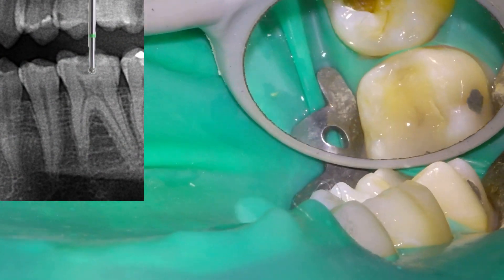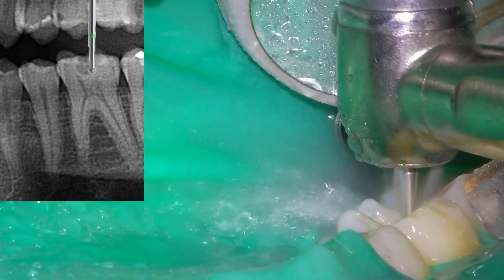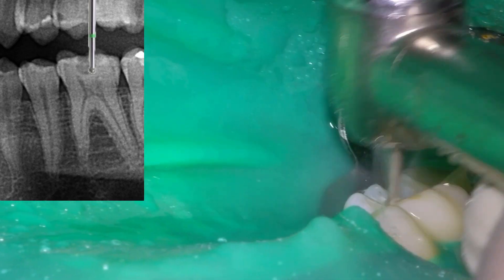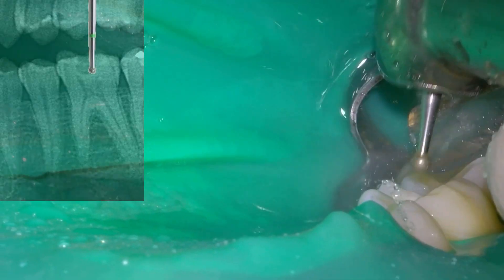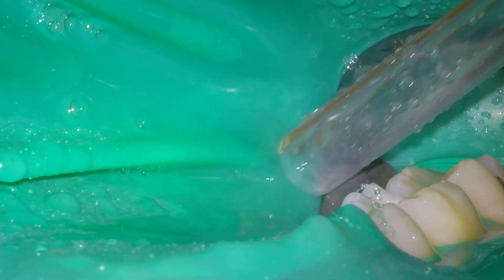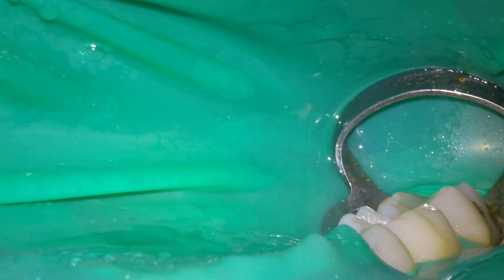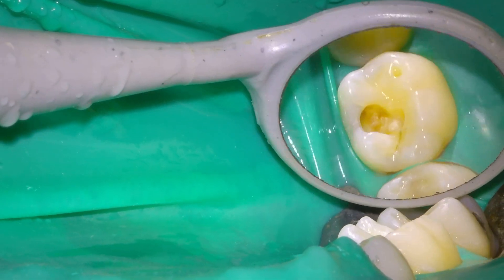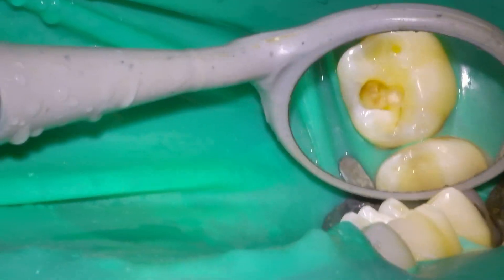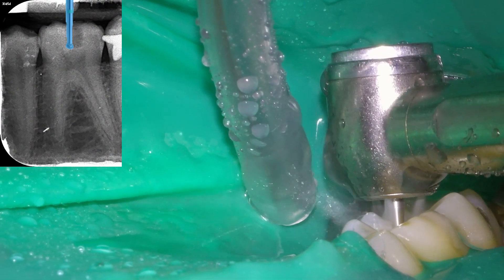I start with a small round burr in the center of the crown, right in the central fossa. Normally I tilt the burr towards distal looking for the distal canal, but we must take into account the x-ray which we will have analyzed before. Little by little, we are going deeper with the round burr.